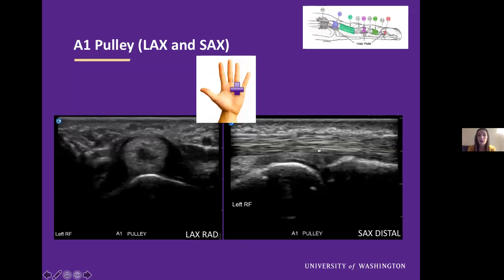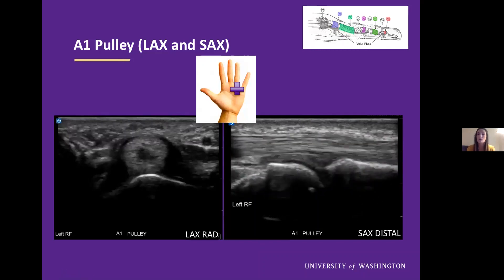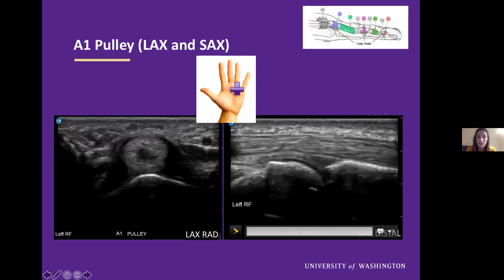Now we'll look at the A1 pulley in the other axis — short axis to our pulley, long axis to our flexor tendons. In this view, we see the pulley as a kind of half circle and it is relatively hypoechoic to the surrounding structures. We'll have the patient perform resisted flexion. Here we're looking for triggering and for any effusion that is evaluated underneath the tendons. I'll also direct your attention to the head of the metacarpal, which is typically circular in appearance and has an overlying hypoechoic articular cartilage — a good landmark.